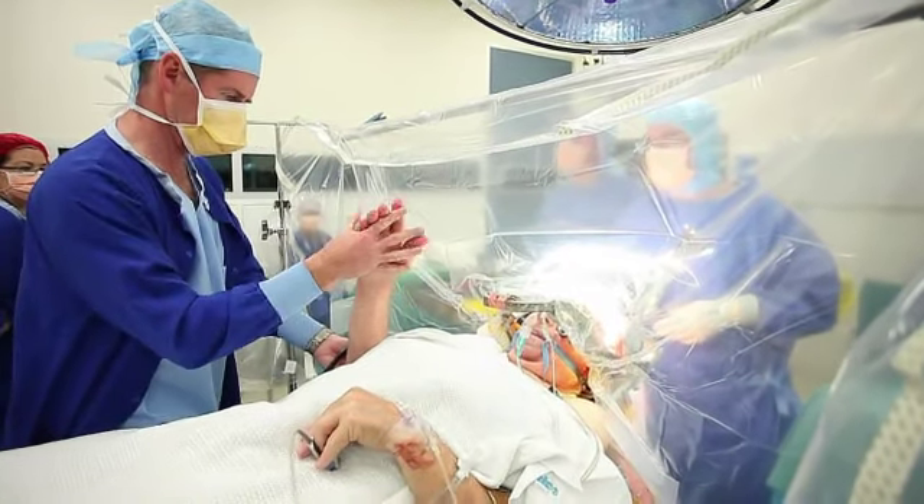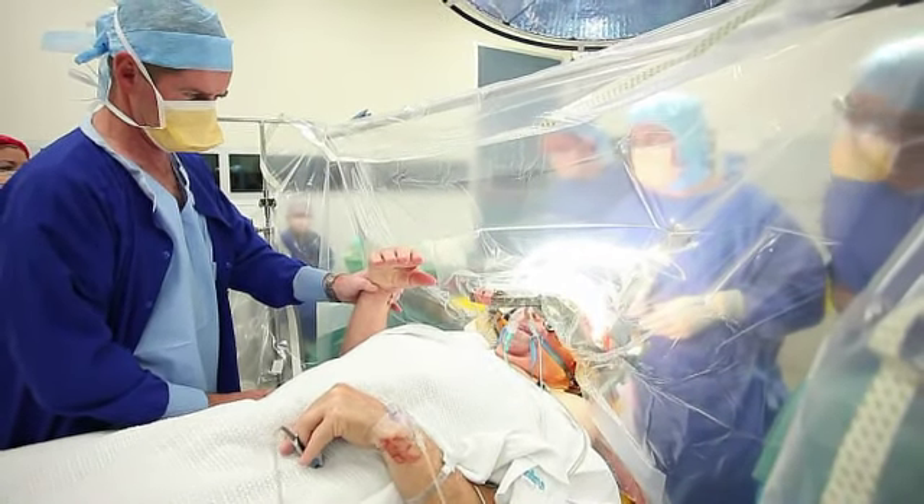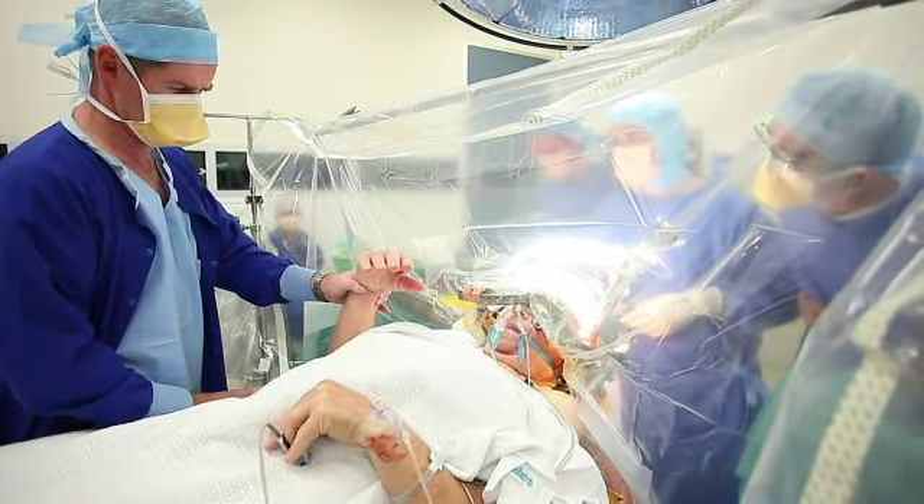When we're stimulating the brain we're looking for a couple of different things. One thing we're looking for is whether passing that electrical current is improving their tremor, making them feel looser, giving them more control over that part of their body — that's very important because that's our objective. But equally as important, we're looking for side effects. There's no point putting an electrode in a spot if it gives a great result for tremor but the patient isn't able to speak, or is experiencing so much numbness or tingling in their arm that it's going to aggravate them when their stimulation is turned on. We want to find a place in the brain that gives a fantastic benefit without producing intolerable side effects.